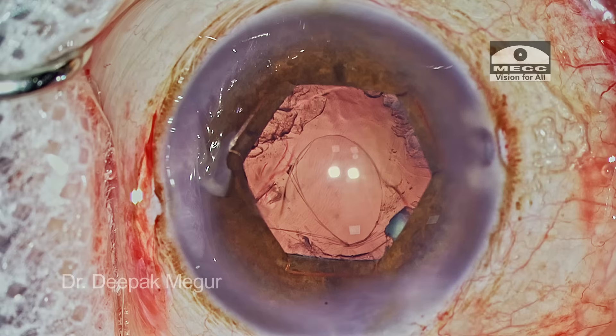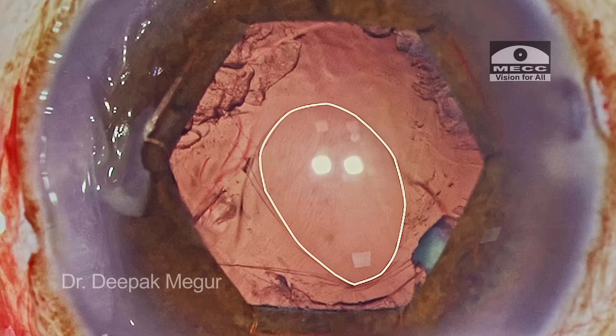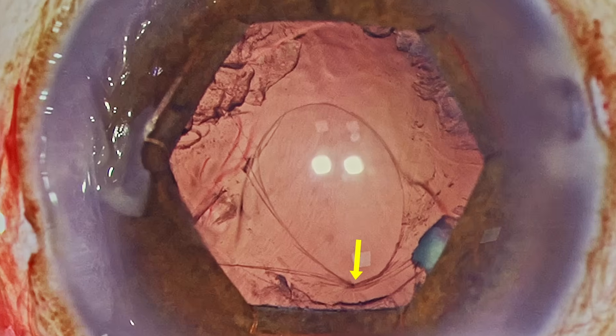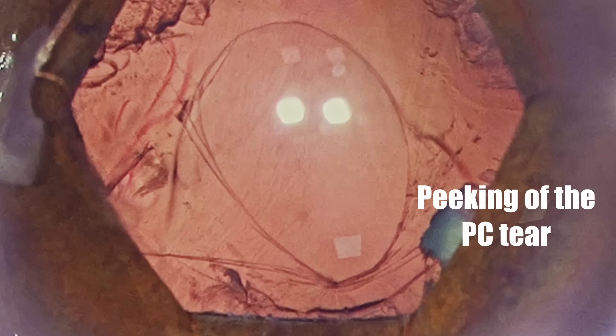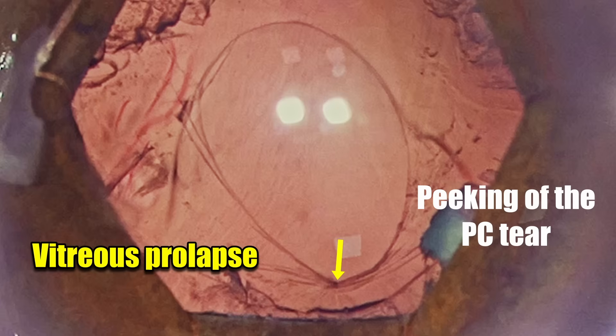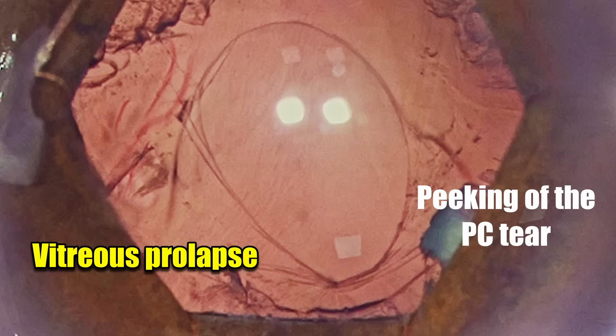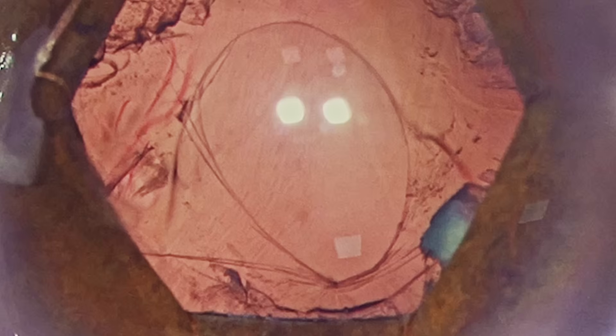Let us look at the morphology of the PC tear. This is the outline of the PC tear. At one end, we can see a kink — an acute bend in the posterior capsule tear. This is very suggestive that a vitreous fibril is prolapsing through this end, and that is what is causing the kink. So you don't have to use triamcinolone acetonide; even before using it, you get a clue that vitreous is already present.